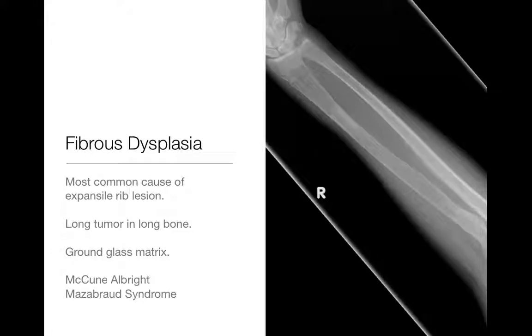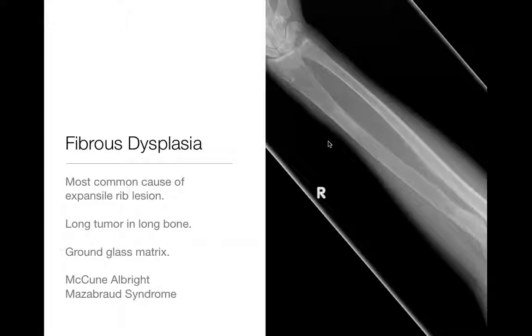F is fibrous dysplasia. Think of it as a long tumor in a long bone. It's classically described as having a ground glass matrix — this smudged-out fibrous tissue that looks kind of smudgy like ground glass on the radiograph. Fibrous dysplasia is pretty common. Usually it's a solitary lesion, a long tumor in a long bone. You can see this one extends all the way throughout the radius, with a pathological fracture because the bone is being thinned out.